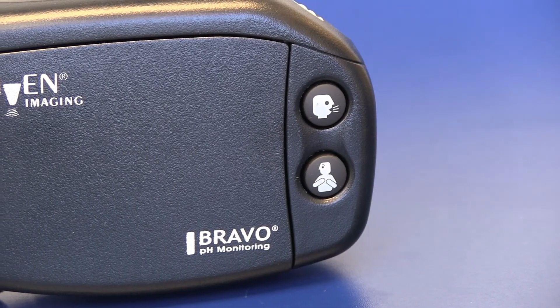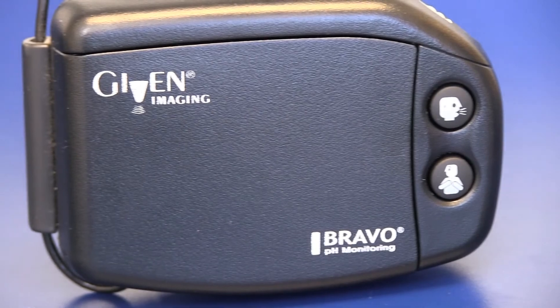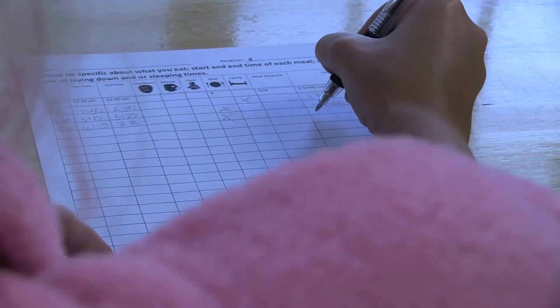It is a 48-hour recording of how much acid is really coming up. During those 48 hours, you will have a receiver and a diary with you. On the receiver there are several buttons for several symptoms, and in the diary he wants to know when you eat and when you lie down.